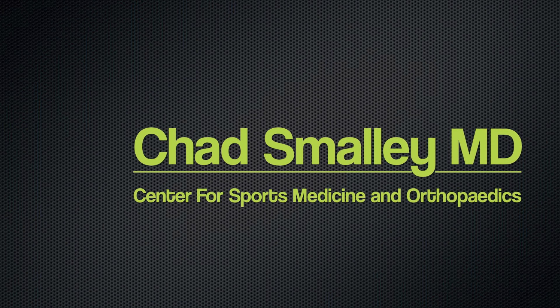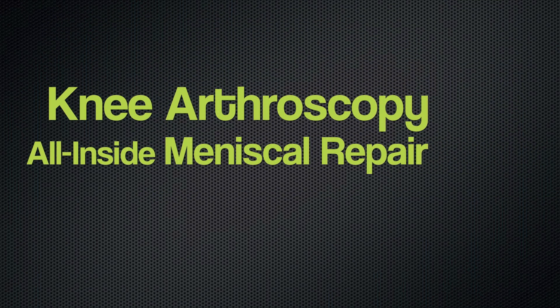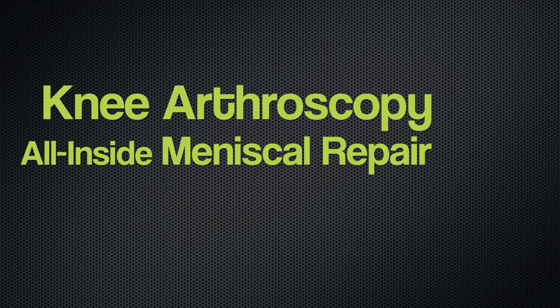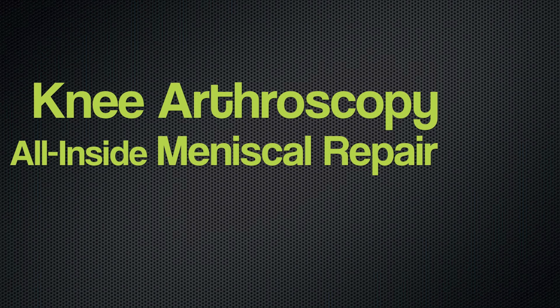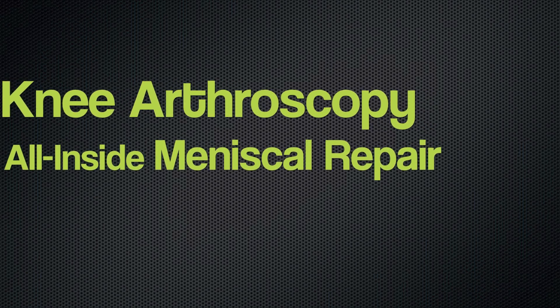This video is intended to demonstrate my preferred technique for an arthroscopic all-inside meniscal repair. Due to the well-documented crucial role of the menisci in load transmission, shock absorption, and secondary stabilization of the knee, my current surgical techniques have focused on preservation and repair whenever possible.